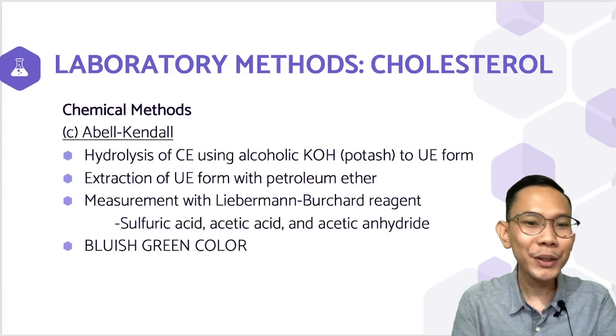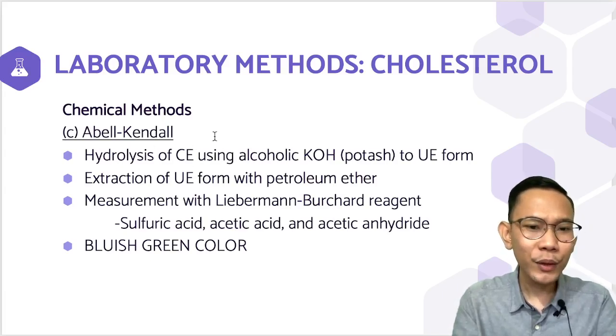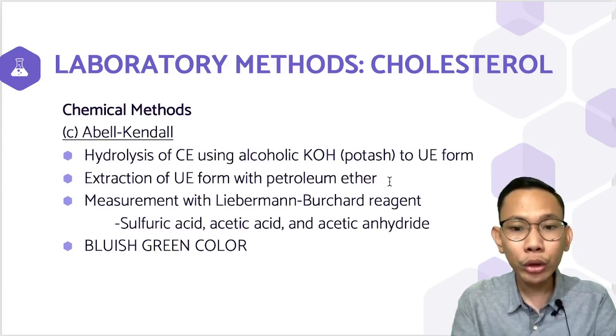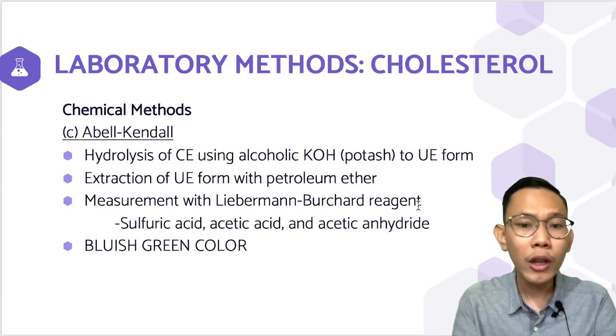We also have your Abel-Kendall test, another chemical method for your cholesterol. It involves hydrolysis of your cholesterol using alcoholic potassium hydroxide or potash to the unesterified form. There will be extraction of the unesterified form with petroleum ether, and then measurement with your Lieberman-Burchard reagent.